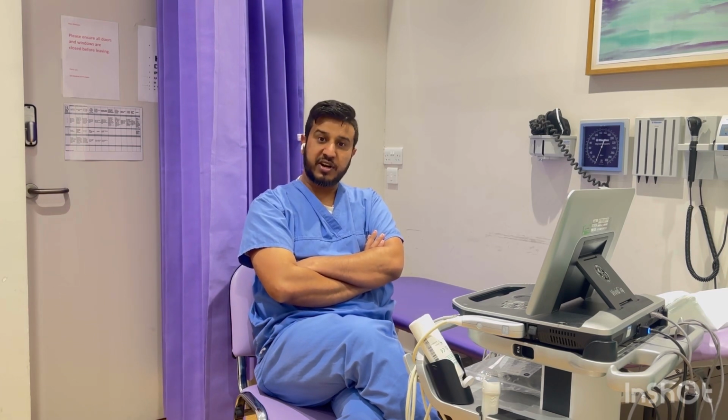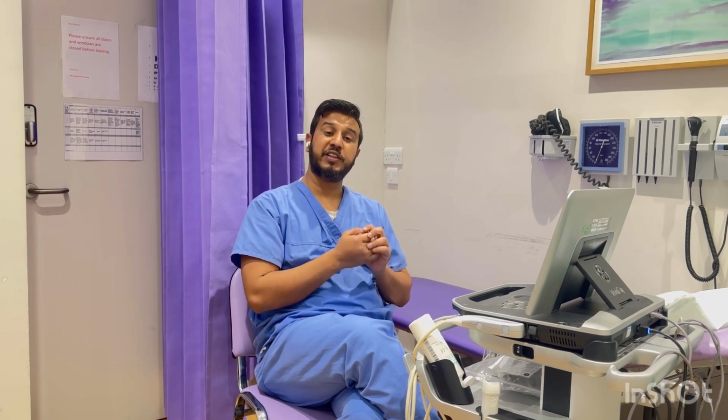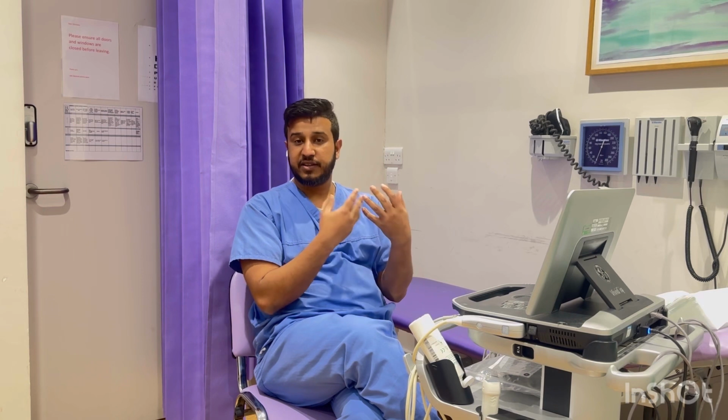So we are going to start the imaging. Today I'm going to explain what the main positions are from where you are going to get the images. You can call them windows, positions, or the areas where you get the images. There are mainly four windows.